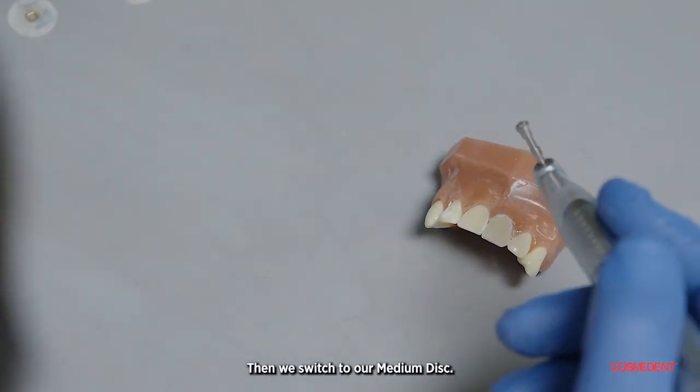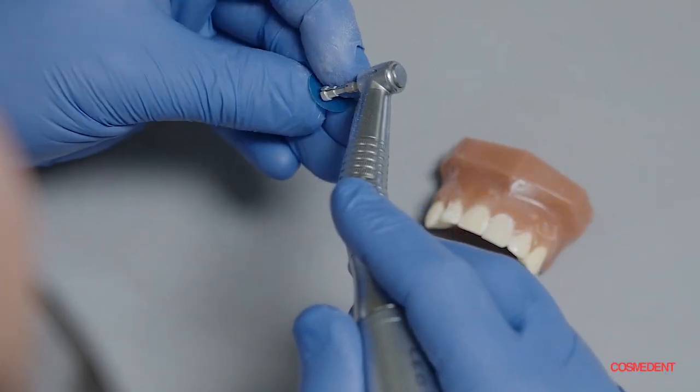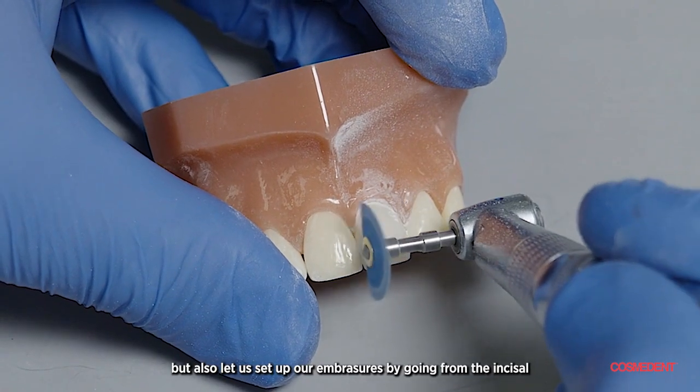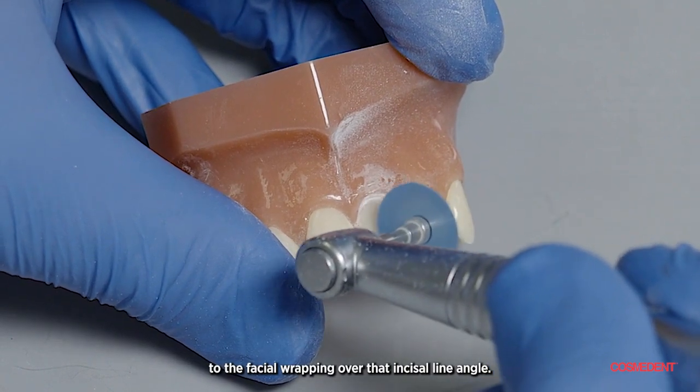And we switch to our medium disc. The medium disc will continue the contouring, but it will also lead us to set up our embrasures by going from the incisal to the facial, wrapping over that incisal line angle.